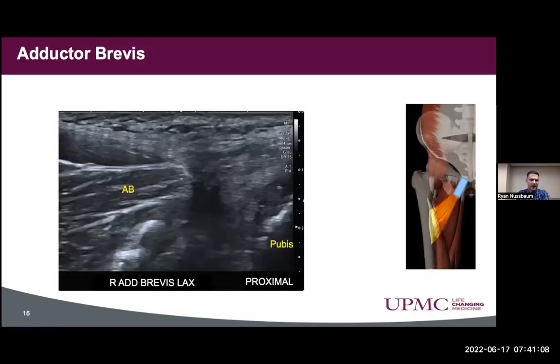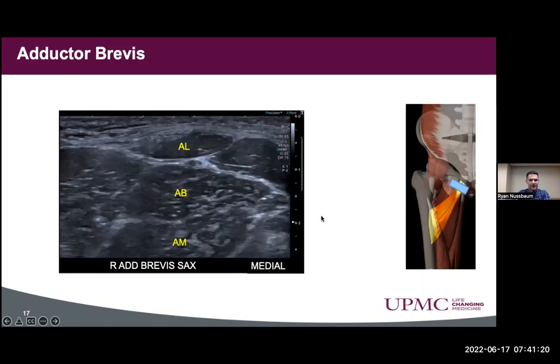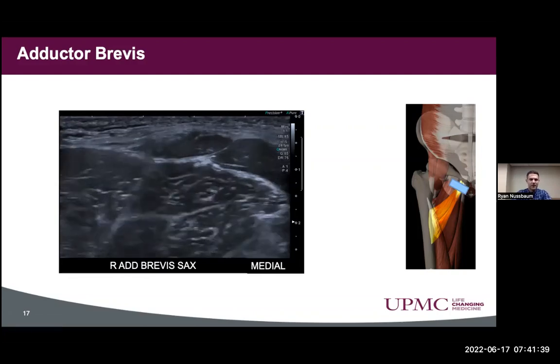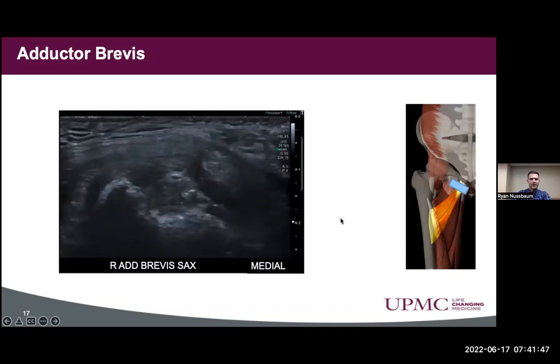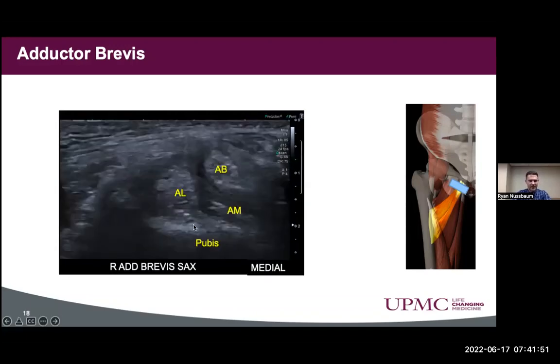Next we looked at the adductor brevis and saw some thickening as it became more proximal, along with some cortical irregularity. Looking at the longus, brevis, and magnus together — we're familiar with orientation from superficial to deep — but what's interesting is that as you go from distal to proximal, the origin of these tendons may not follow that same order. The adductor longus actually went deeper, the brevis stayed in a similar area, and the magnus was also deep — a different configuration than you'd see three to four centimeters more distal.